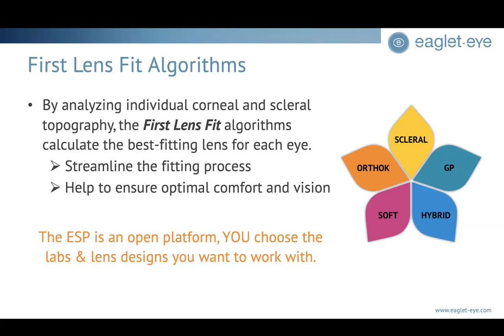We're going to see what we're dealing with, and we can make decisions about what we're planning to do, pull starting lenses and so forth. Now, the first lens fit algorithm allows an automated, streamlined fitting process where you can select the lab and lens design that you want to work with.